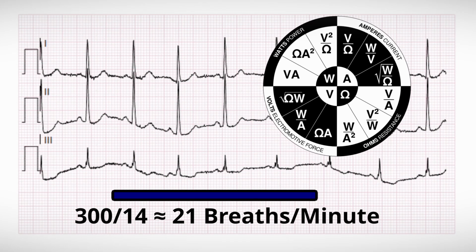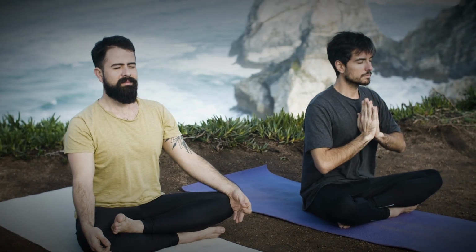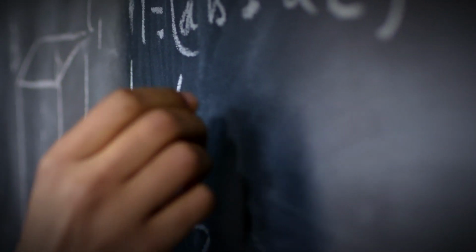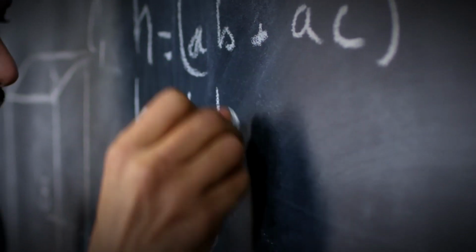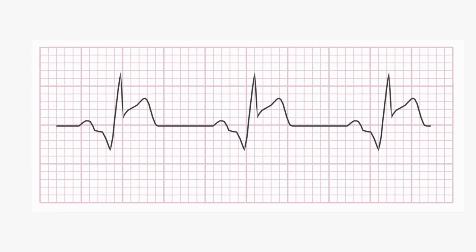Modern EKG machines can normally correct for this, but the same phenomenon is used by some devices to measure respiratory rate. This is the centered brown electrode that you see on some hospital telemetry systems. In this circumstance in particular, the monitor will eventually catch up and actively cancel this wander out. So we'll get to how that actually works someday, maybe. I guess at some point I'm going to have to tell you what the right leg electrode does, don't I?